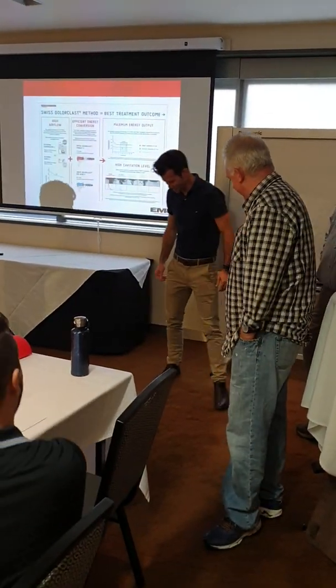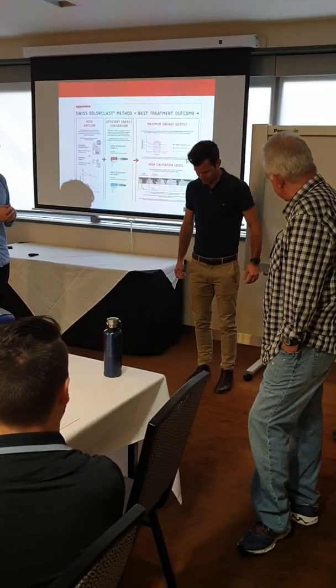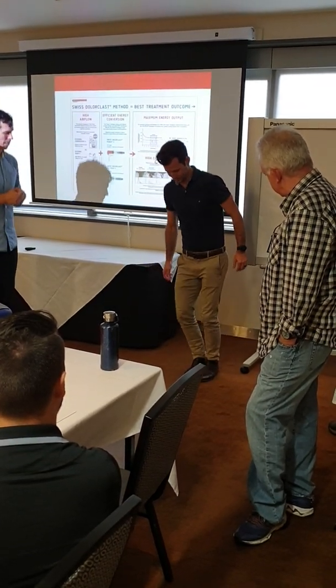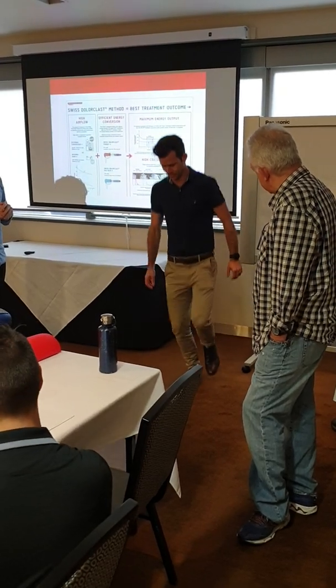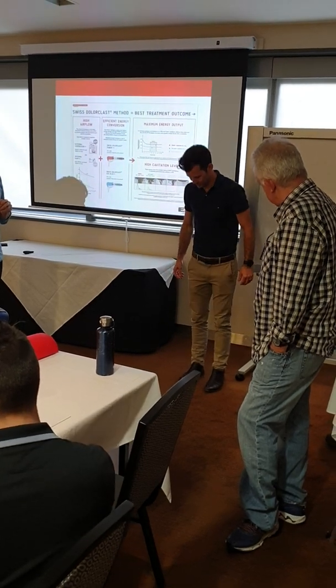How's that? Just try doing the single leg. The double leg hop. Single leg hop. Yeah, feels good. Less tender than before? Yeah, just less tension.